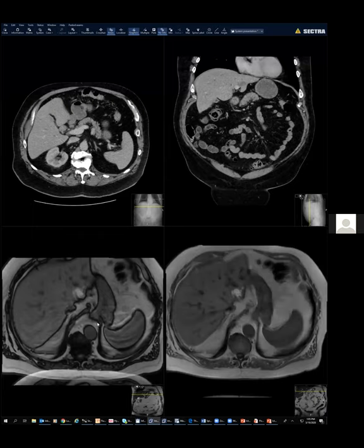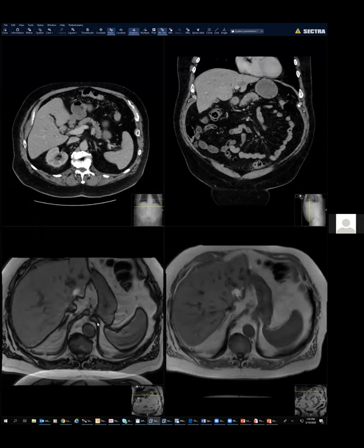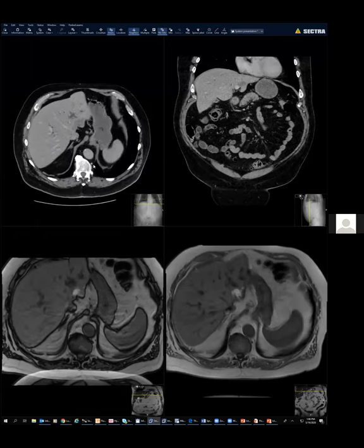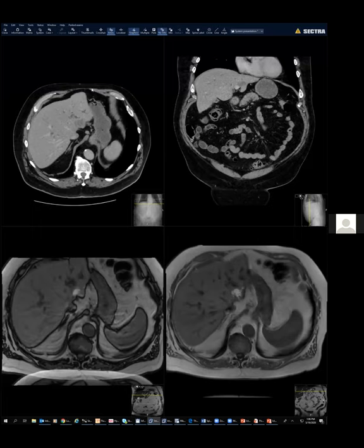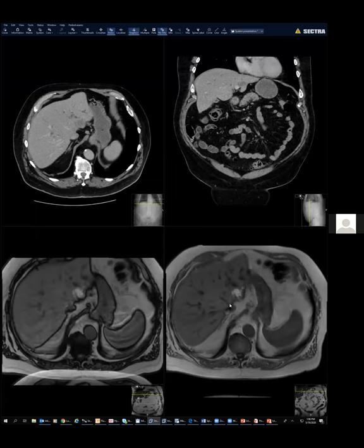Anu asked: this is pretty extensive — was there any component in the parenchyma, or was all the soft tissue limited to the biliary system? It was all limited to the biliary system. There was one component I thought may have been parenchymal, but on the T1-weighted images it is hyperintense on in- and out-of-phase, so I think that's inspissated bile within dilated ducts in that area.